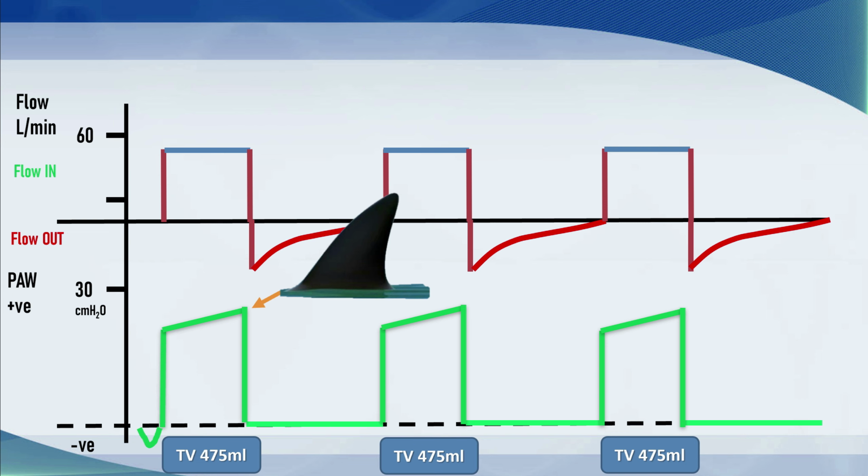So this is volume control and volume cycled breath, right? So the breath ends as soon as the peak pressure is reached. So the volume goes in and then it immediately cycles to expiration. And you'll see that there is no inspiratory hold between the end of inspiration, that's the end of the blue line on the flow waveform, and the beginning of the red line. The two brownish lines are just interconnectors because it's on the same screen.